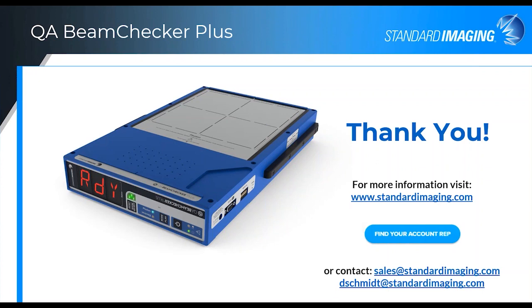Question about the recalibration frequency or rebaselining frequency, I would say. We do typically see customers rebaselining in the 6 to 9 month range. Certainly any time that there has been any major surgery to your device, certainly on an annual basis. But again, remember, you're just taking a snapshot of the beam and you're reviewing that data perhaps on a weekly basis, trying to identify are any changes occurring in my system.